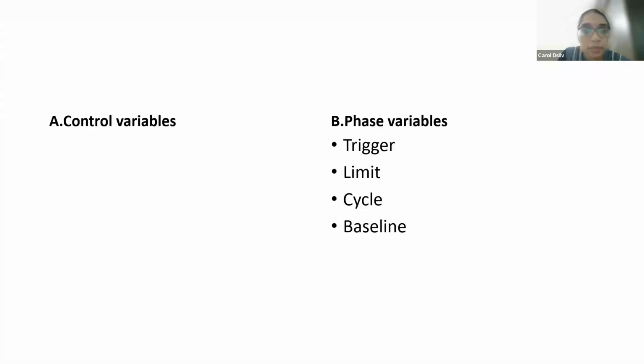So when I say the term limit variable, a limit variable is a variable that doesn't cross a particular limit throughout inspiration. So typically in volume controlled, it's usually flow. If it's pressure controlled, it's usually pressure. What you set, the pressure, that's what it will maintain. It will go from 0 to that set pressure and sustain it throughout inspiration.